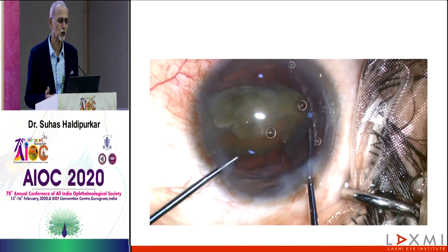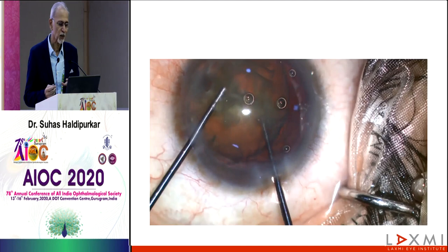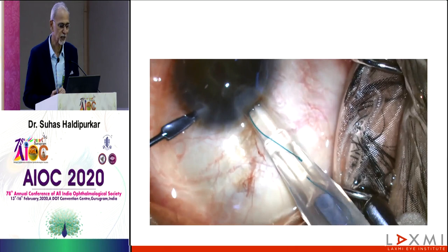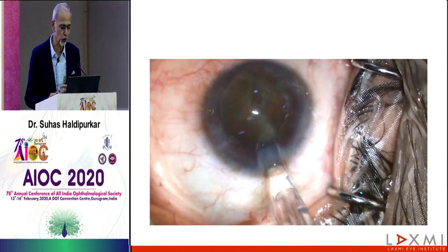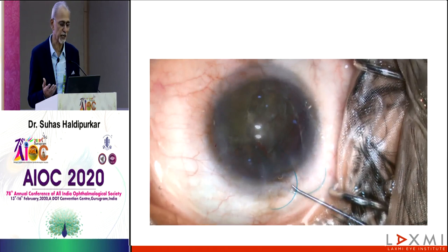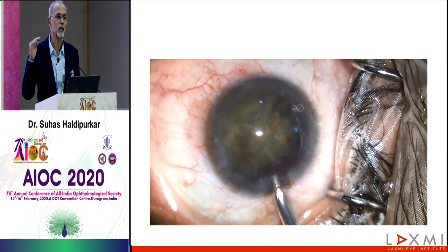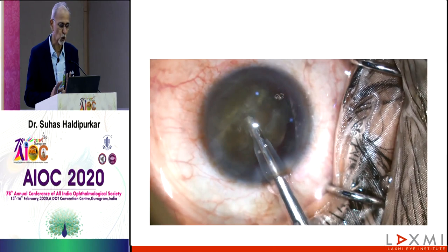Here, in fact, I tumble it, and then inject some more viscoelastic so that I have a nice cushion underneath and above. And then thanks to our friend, I also joined the bandwagon of scaffolding. And now you're bold enough because your rexis is intact. Even if the leading haptic is in front of the iris or behind the iris, as long as it is not behind the capsule, behind the tear, you're just okay with it. And just go about your phaco in the normal way.